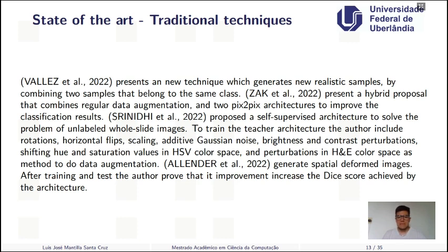Well, the augmentations applied in this paper are, for example, rotation, horizontal flipping, scaling, additive Gaussian noise, brightness and contrast perturbations, and others.